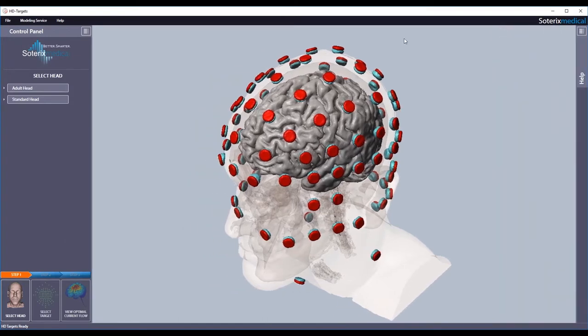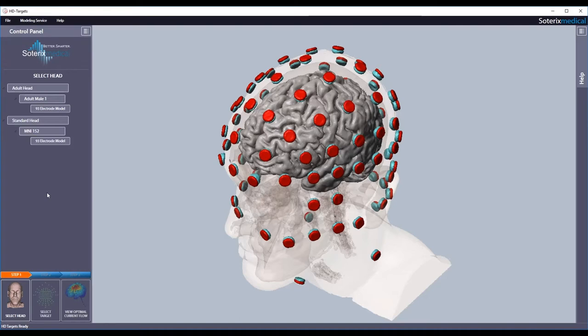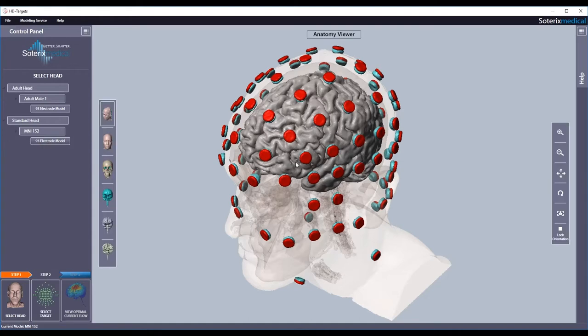Your HD Targets will come preloaded with one or more head models. In this case, the basic HD Targets comes loaded with one adult male head and one standard MNI-152 head. Additional head models available include more adult male heads, adult female heads, pediatric heads, and also heads with lesions, for example after a stroke. Let's select the standard head and the default 93 electrode density option.